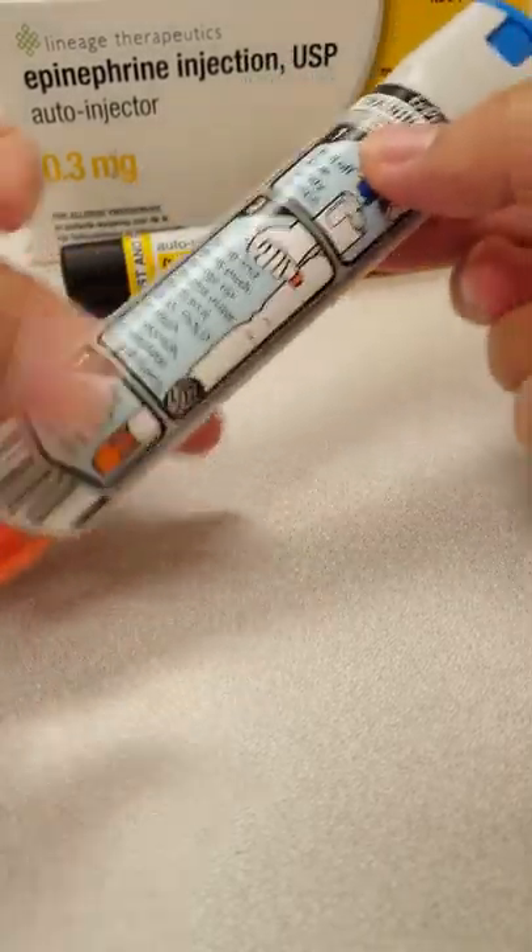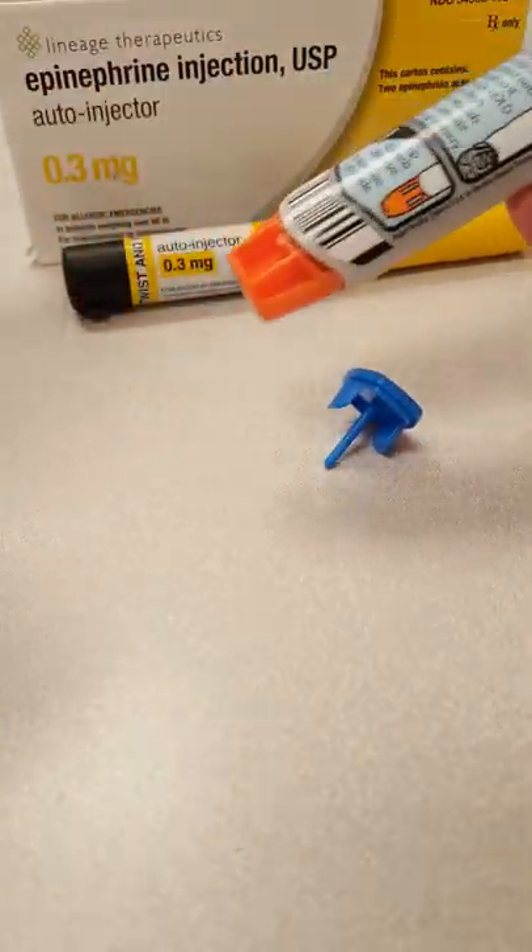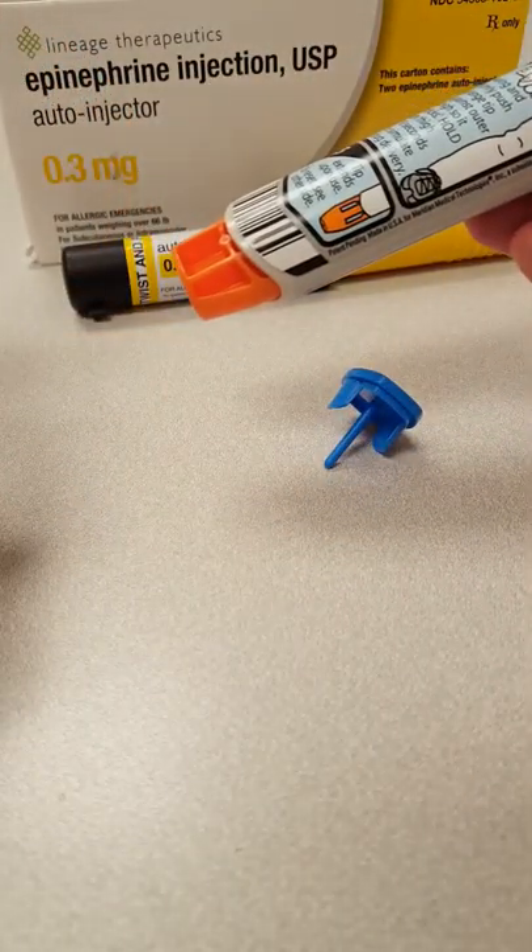With the training pen there are instructions on it. You want to take off the blue cap on the top. For the actual one, there will be another cap here to take off as well.